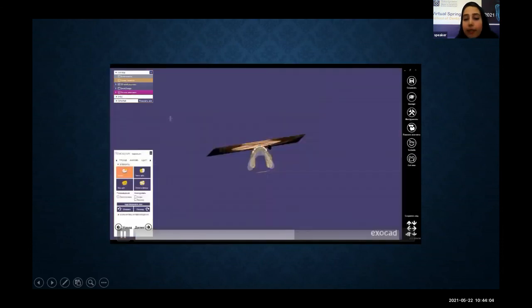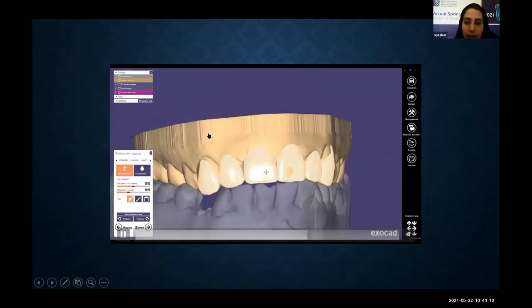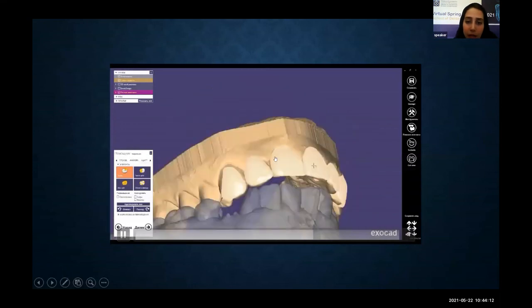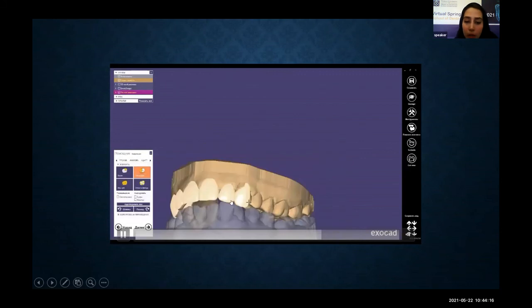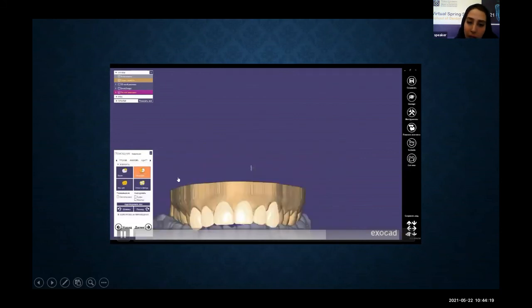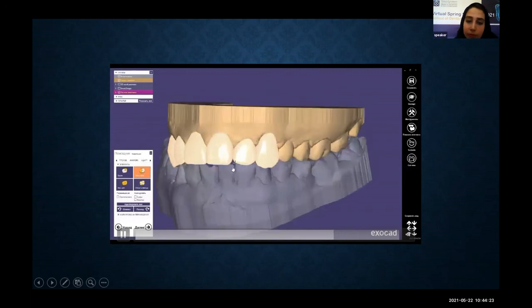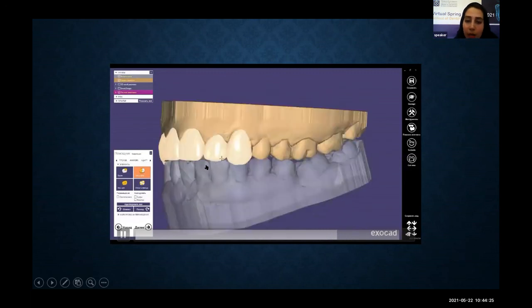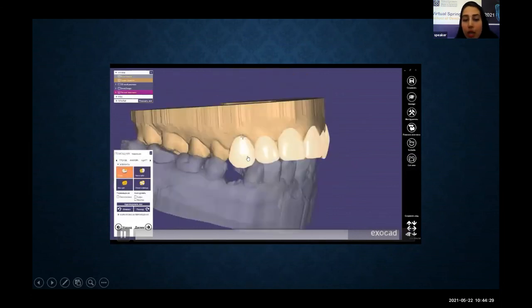And after that, when it's acceptable for the face, we can go further on the cast and adapt the design to the gingiva of the patient, to check about the occlusion, to make harmony with the other side, and some modification and correction in embrasures, as you can see here.